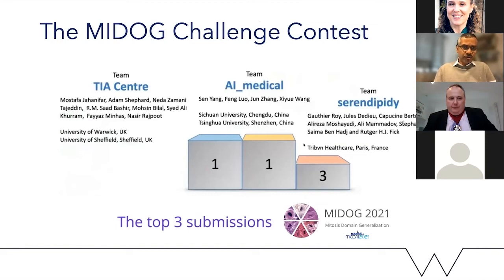And I think, again, it goes to show that these algorithms are now able to match human performance or come close to human performance. And I would regard this one, again, as one of those low-hanging fruits towards the left end of the spectrum. I'm sure most pathologists are very good at recognizing exactly where the mitotic cells are and counting them. In case of breast cancer, for example, if you're following the Nottingham grading system, this is one of the key things that you would be doing on a daily basis, and in several other cancers as well.